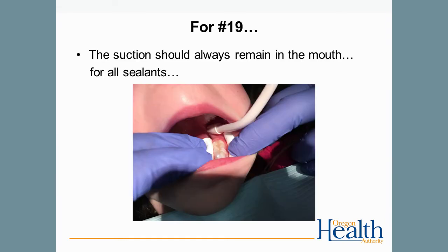For tooth number 19, the hygienist holds the lingual cotton roll and the assistant holds the buccal cotton roll. As for all sealants, the suction should remain in the mouth as often as possible. And ideally, the lower lip should be retracted to increase the field of vision.